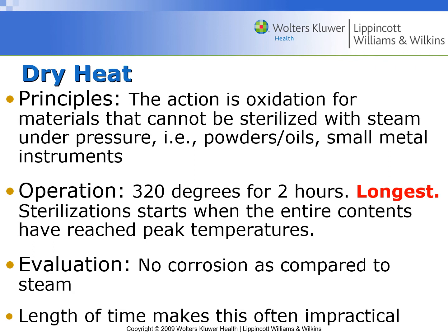Then there's dry heat. Dry heat, the action here is oxidation for materials that can't be sterilized with steam under pressure. For instance, a lot of things that the dentist uses, very small metal instruments like burrs and things, powders, oils, things like that may have powders or oils on them. They need dry heat, not a moisturizing heat.